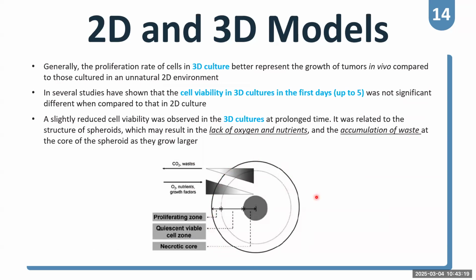So what I want to point out to you is that you have to monitor the organoid yourself, day by day, week by week, and observe the organoid from each individual patient. Okay, you have to keep a record form to record the size of the organoid, how long it takes to grow, and how long until it is suitable to subculture the organoid and grow it again. You have to do that for each individual patient.